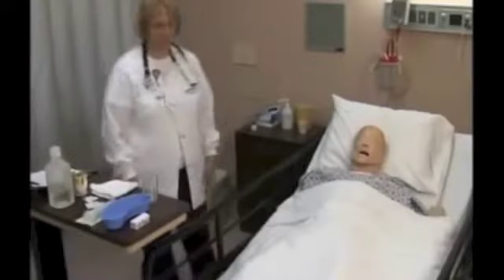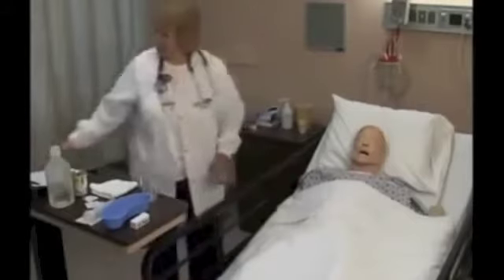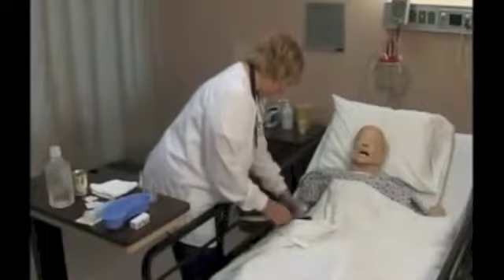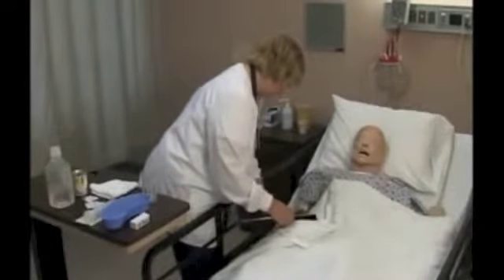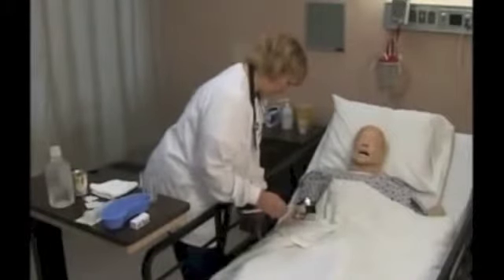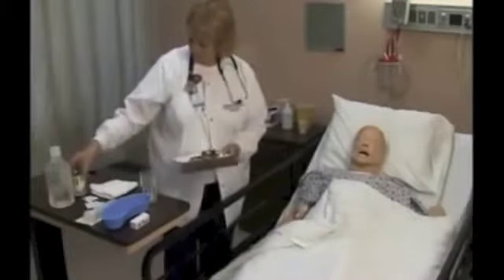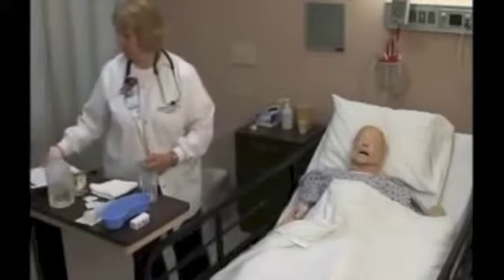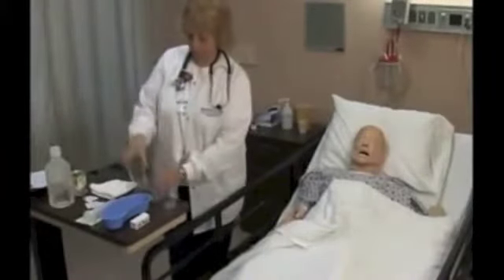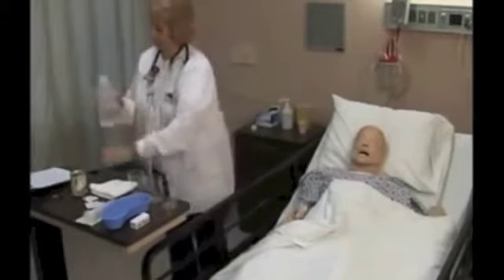Introduce yourself to your patient and explain what you will be doing. Check the ID band name and number, compare with the order sheet, read it out loud, and have the patient state his or her full name. Check the doctor's order for the ordered tube feeding. Assemble the supplies on the bedside table. Pour desired amounts of flush solution and tube feeding.